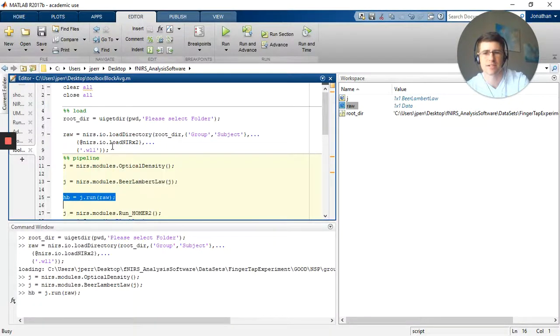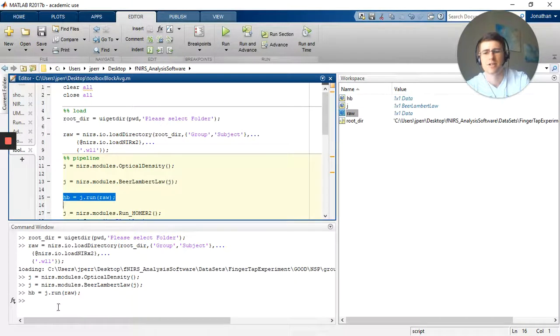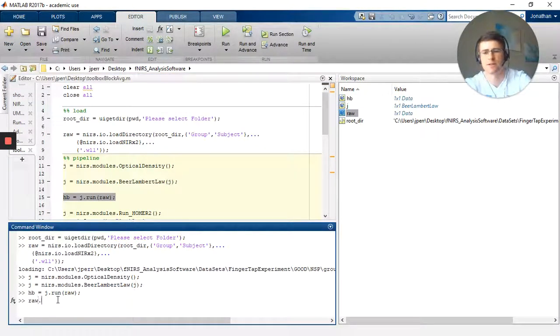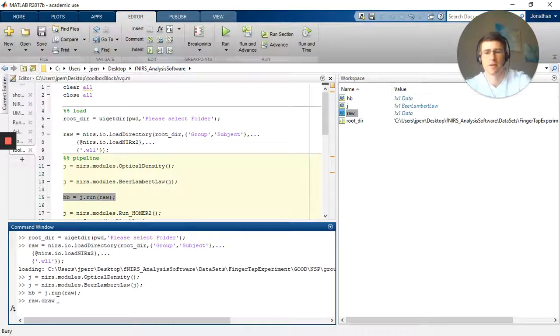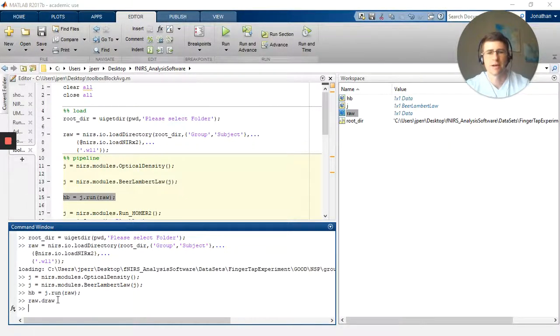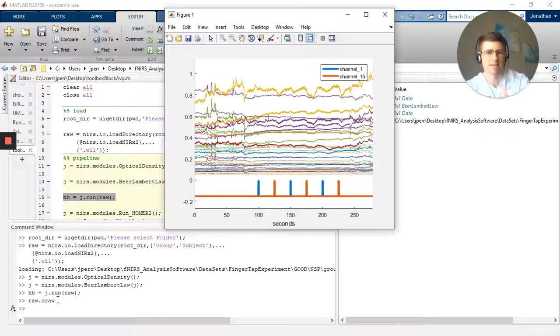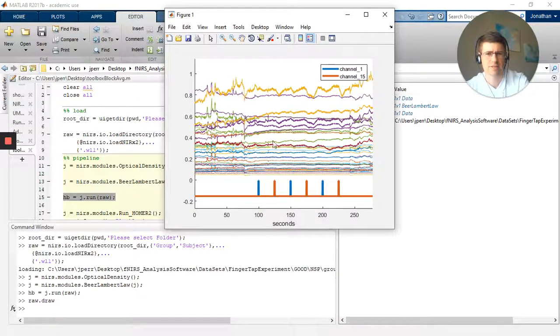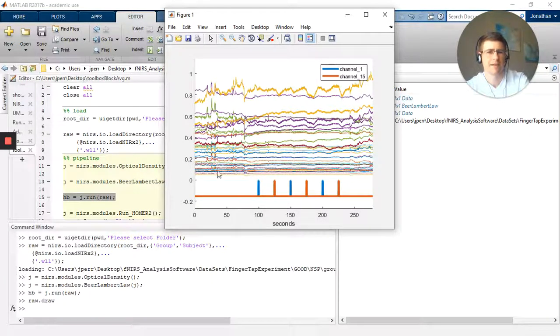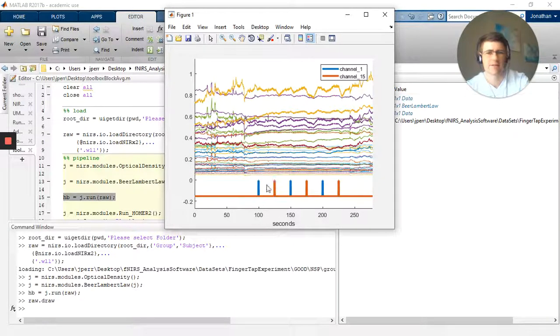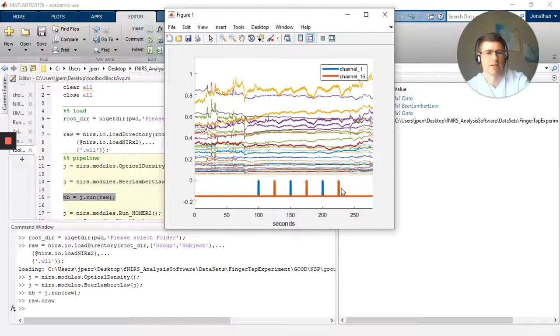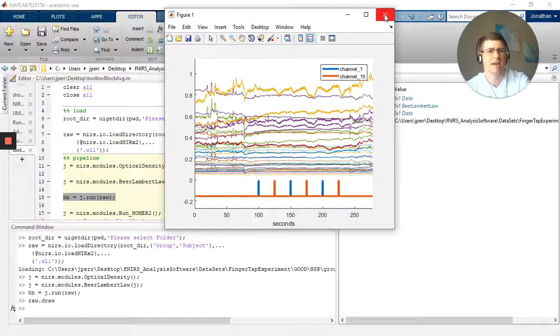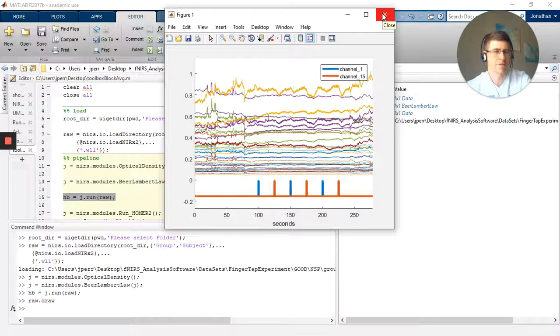So you can take the raw data and you can do raw.draw. I do that and you get this lovely pop-up. You have the voltages from about 0 to 1, each channel times two wavelengths. Then you have the stimuli, so when the events were actually occurring. Very nice. You'll see they're called channel 1, channel 15. They're actually left and right finger-tapping, but they default to whatever trigger value is sent.